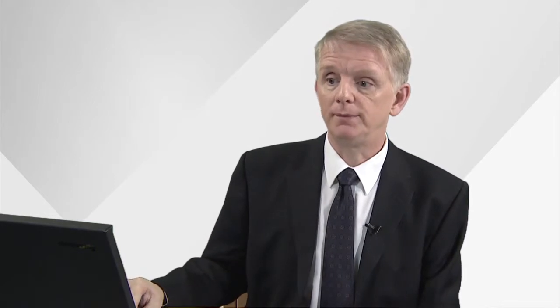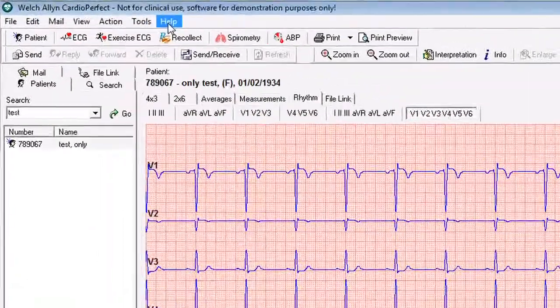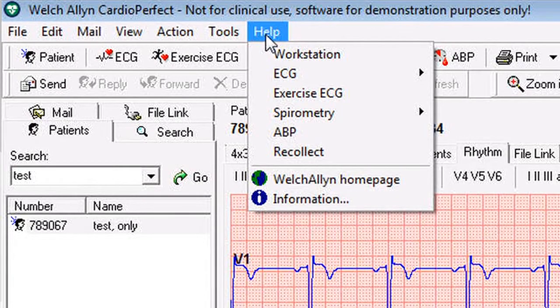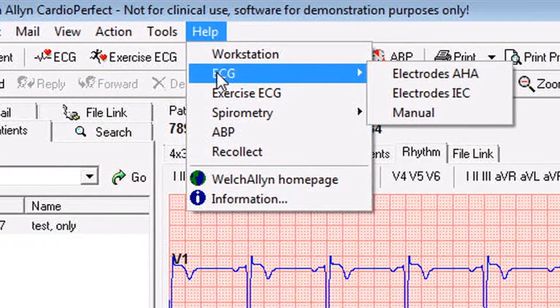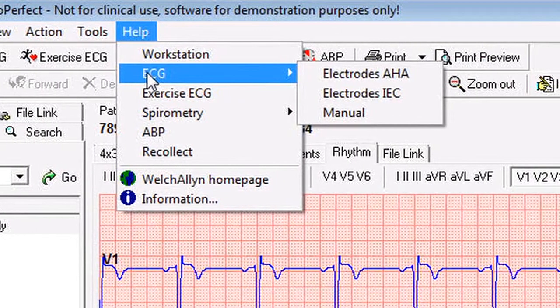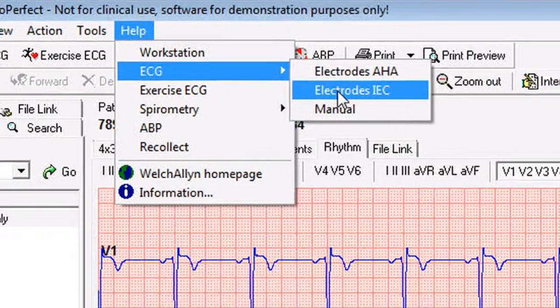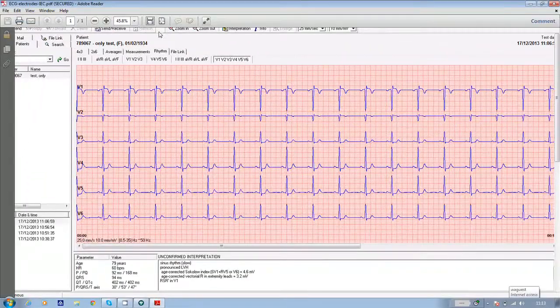If you need help with patient preparation or correct lead placement, there's a useful graphic in the Welsh Allen software. Go into the software, click on the help icon at the top of the screen and from the drop down menu, select ECG followed by electrodes IEC and the graphic will appear on screen.